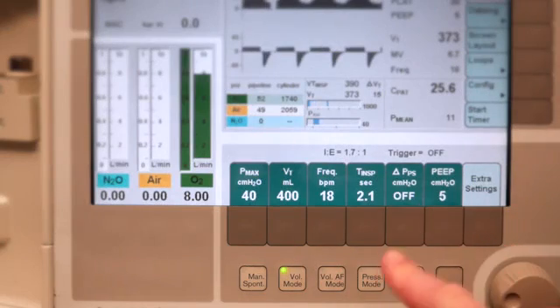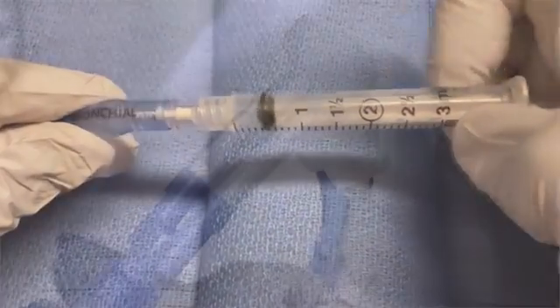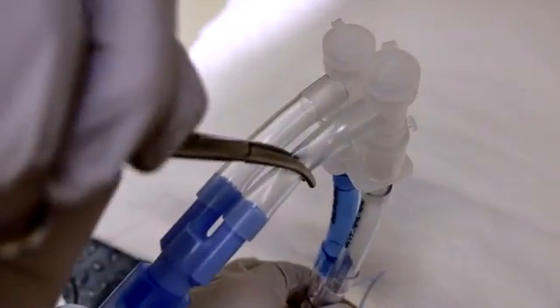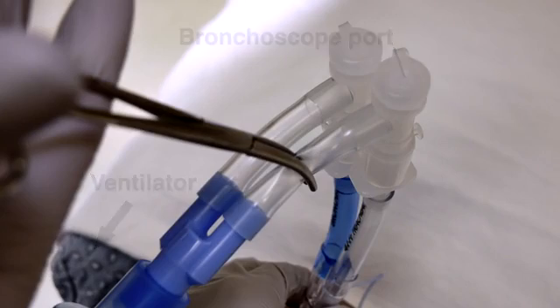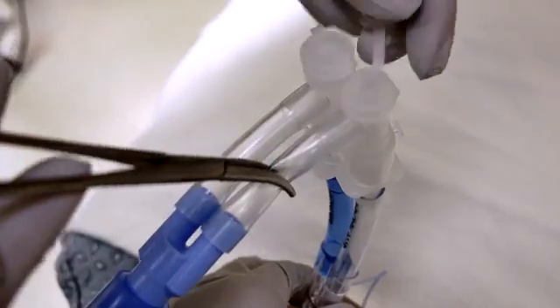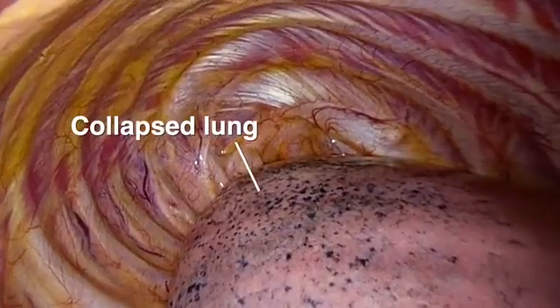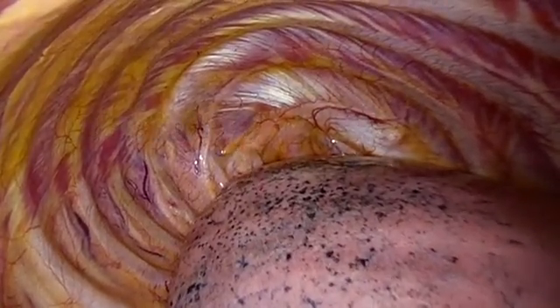Before initiating one-lung ventilation, adjust the ventilator settings and inflate the bronchial cuff. To ventilate the lung distal to the bronchial lumen, place a clamp on the tracheal lumen of the Y connector between the bronchoscope port and ventilator. Then open the bronchoscope port of the tracheal lumen, which is connected to the non-ventilated lung. This will allow the non-ventilated lung to collapse as the other lung is selectively ventilated.